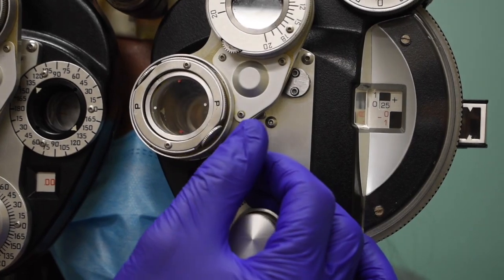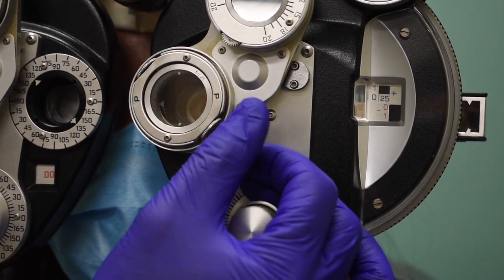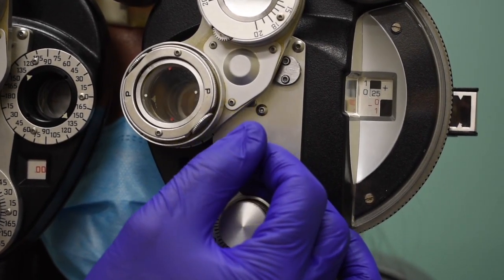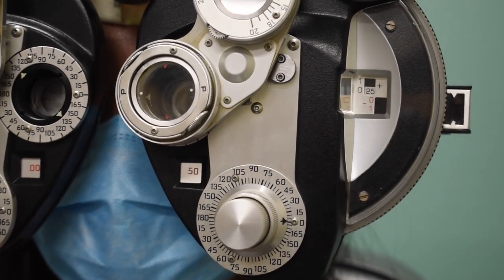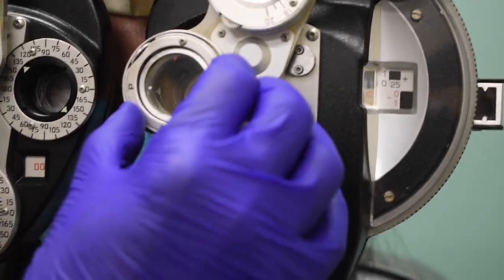Are those letters more clear here with one or here with two? One. Excellent. So now she's telling us she's done. She doesn't want any more so we can begin our axis refinement.